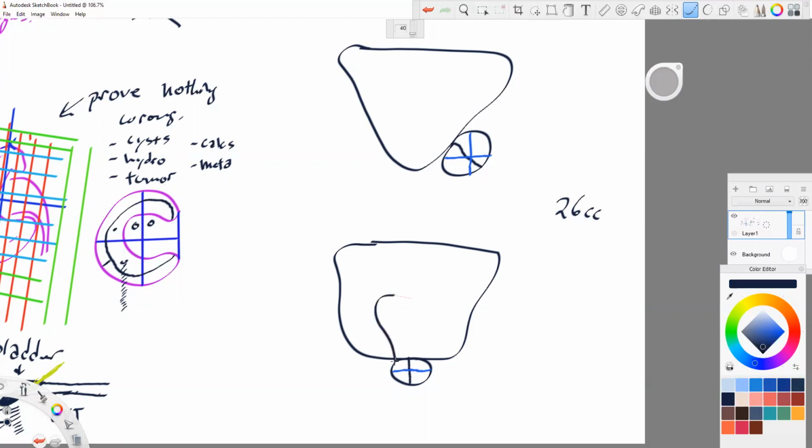I've actually seen this. That's obvious. If you have a prostate that has that size to it or that dimension to it, that's obviously enlarged. Otherwise, there could be just overall enlargement as well. So just keep an eye out for that.